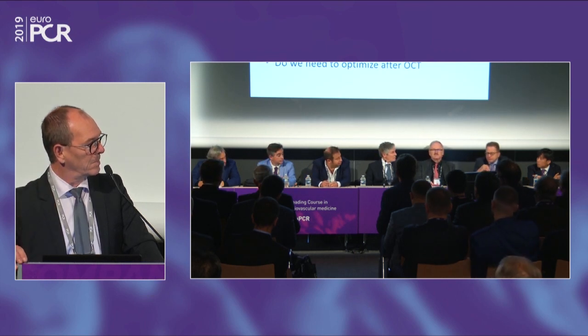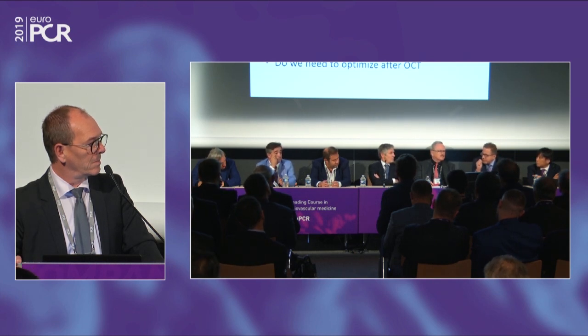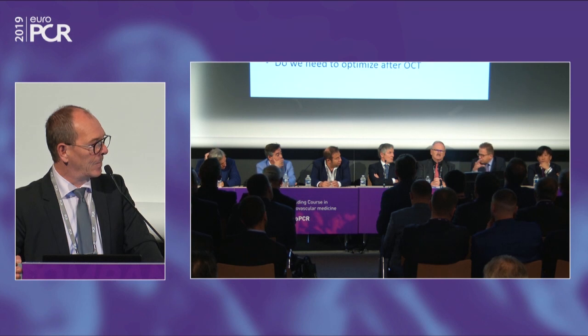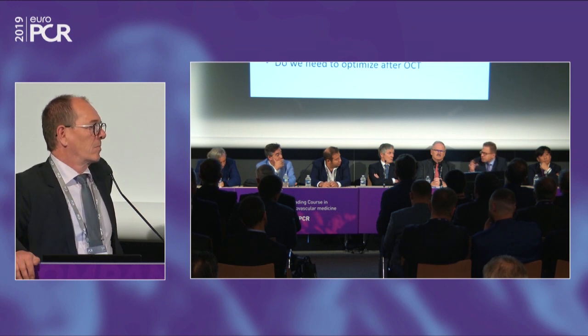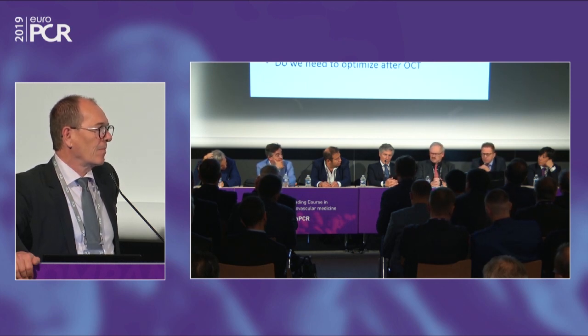Okay, may I comment, just to answer your question. First of all, we really strongly recommend IVUS assessment. Based on that, you can avoid coverage of the proximal part of the left main. Then all these three lengths, 16, 19, and 24, fit the majority of cases. In other situations, you have to add thin strut stents to prolong the stent. This is one issue. It's not necessary to cover from the ostium of the left main for everyone.